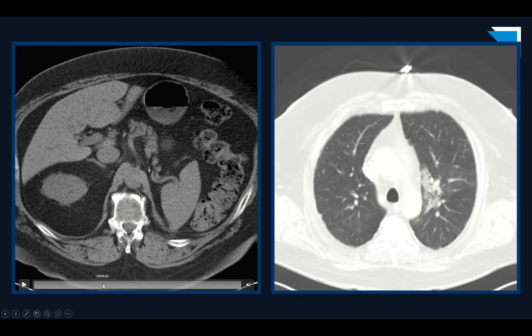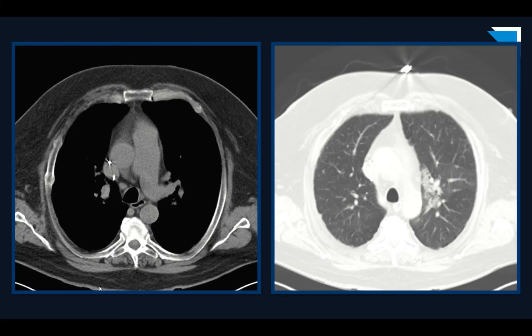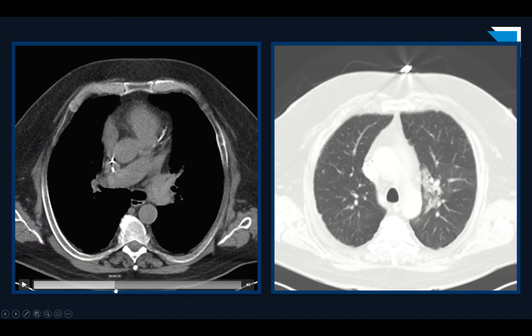This case demonstrates the importance of sticking to a search pattern. If your pulmonary arteries are on your search pattern, whether it's a non-contrast CT or contrast CT, then you've got a chance at spotting the finding here. If not, then you have no chance.